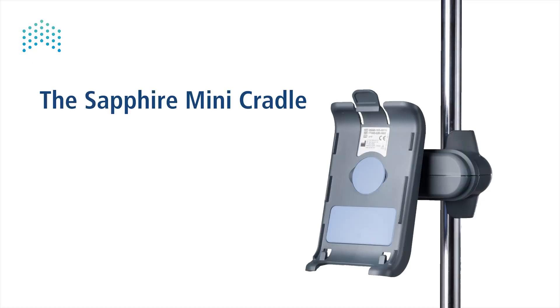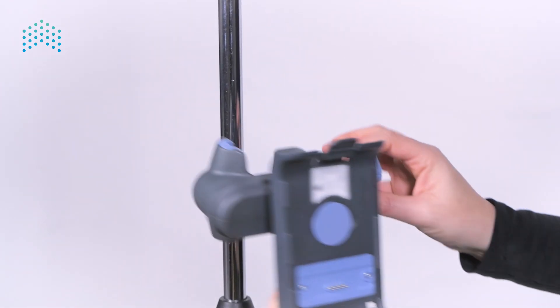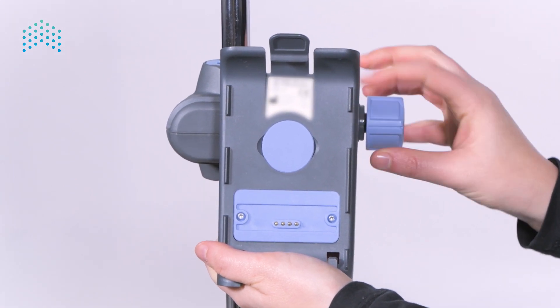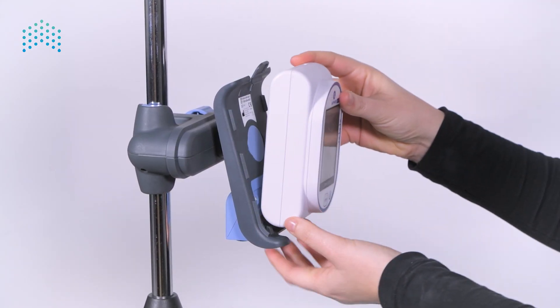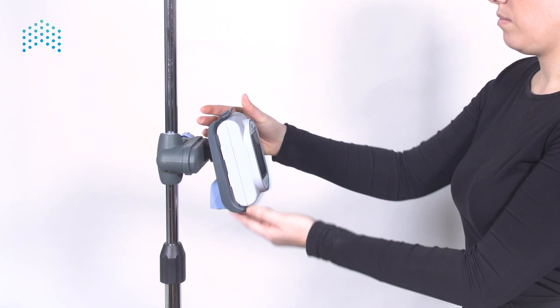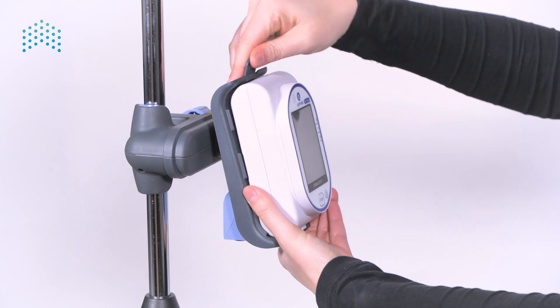The sapphire mini cradle — the sapphire can be mounted on the mini cradle. First, attach the mini cradle to the IV pole by rotating the knob on the right and tightening it to the pole. Mount the pump onto the mini cradle feet first — place the bottom part first, then click the top of the pump into the cradle's latch. Remove the pump from the cradle by holding the pump in one hand and pushing the cradle's latch with the other.